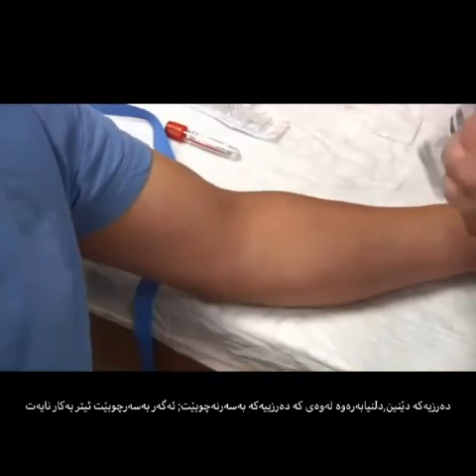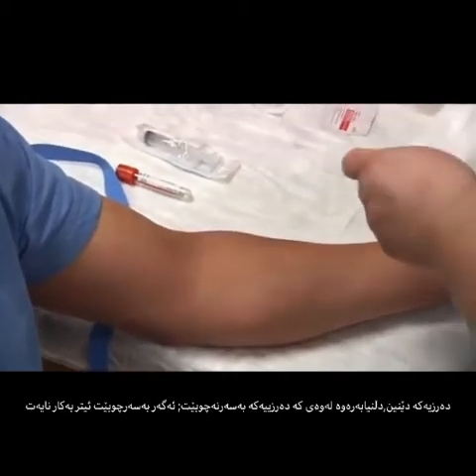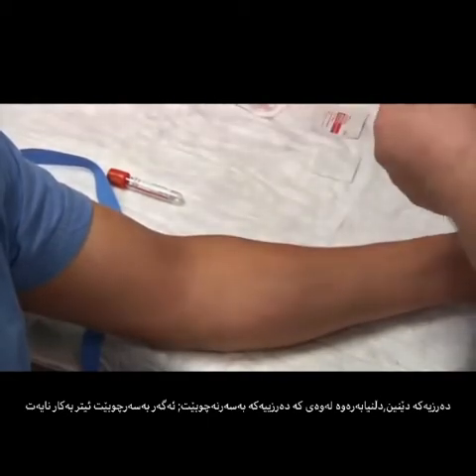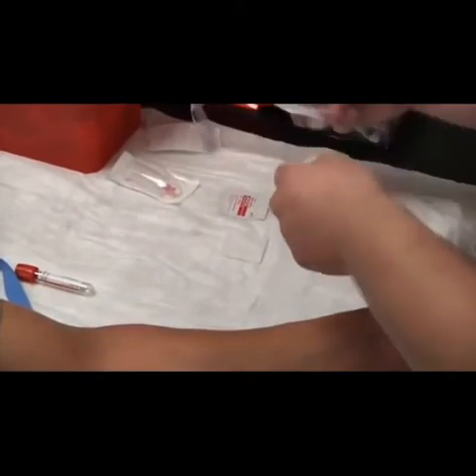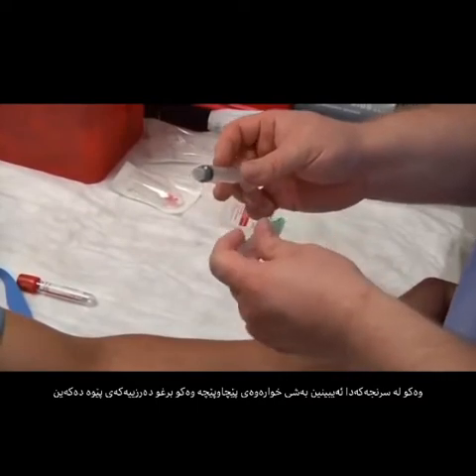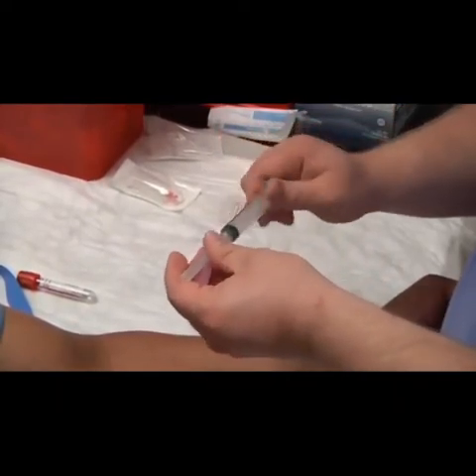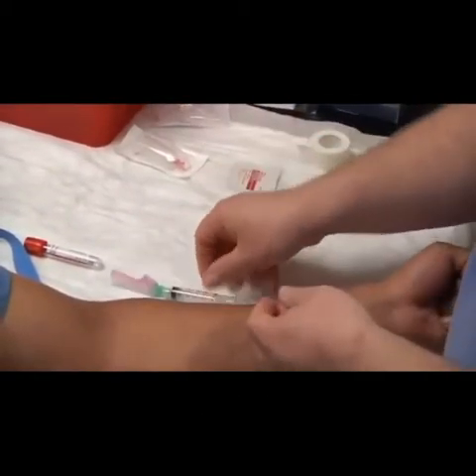Assemble our needles. Make sure that our needles are in date and our syringe is in date — if this was expired, then the needle and the syringe would no longer be sterile. With our syringe, you'll see there's a luer tip in here. What luer means is thread, so we can thread this on like a screw until it's good and tight.